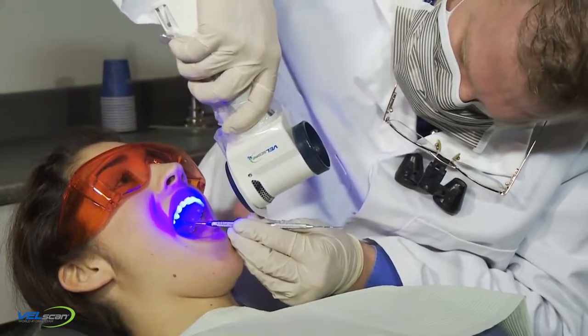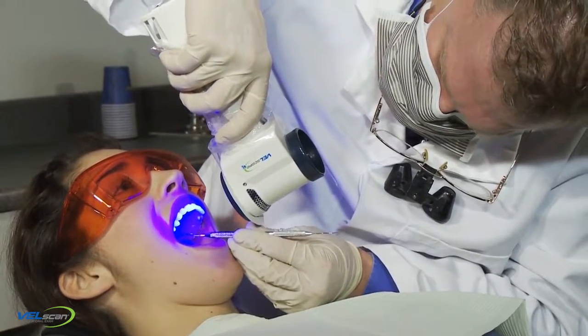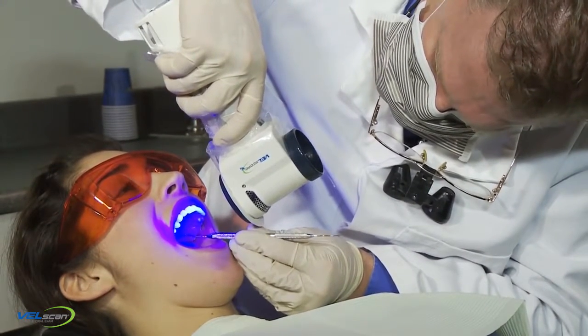Fluorescence is typically lost in areas of inflammation. If fluorescence returns when you compress the tissue, there may be an inflammatory component to the lesion. It's important to note, however, that dysplasia can also be accompanied by inflammation. If a lesion does not completely blanch when compressed, heightened observation is warranted.